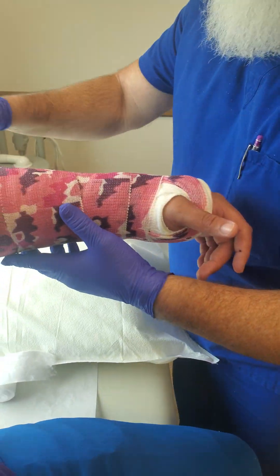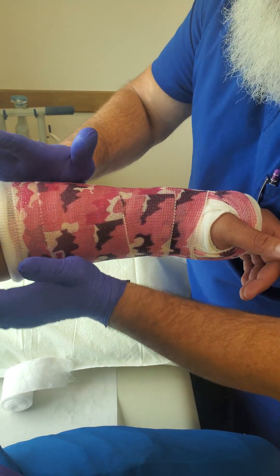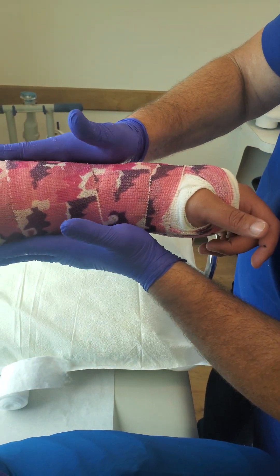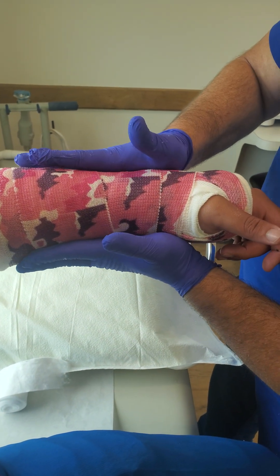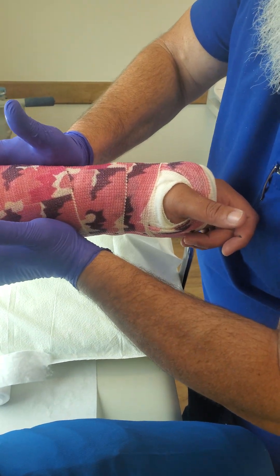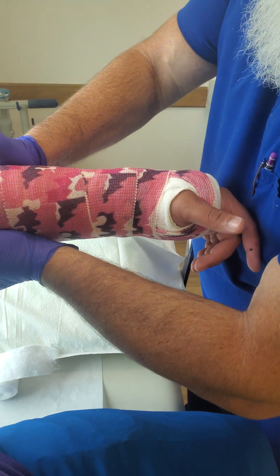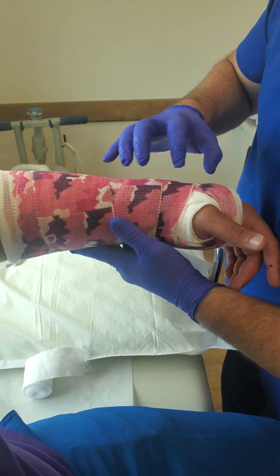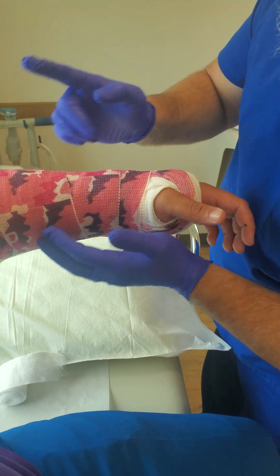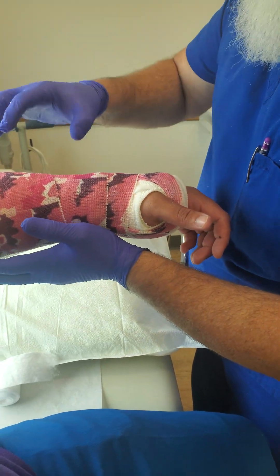— is that it takes away the rotation. It decreases the rotation quite a bit, and it lays anatomically correct with the two long bones. So by doing this interosseous mold, you're decreasing the rotation of the forearm. The cast itself takes care of the rotation of the wrist.